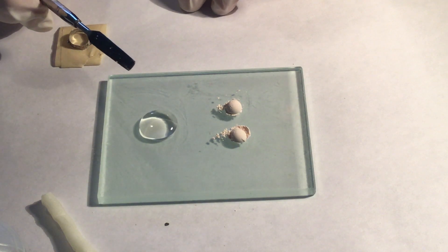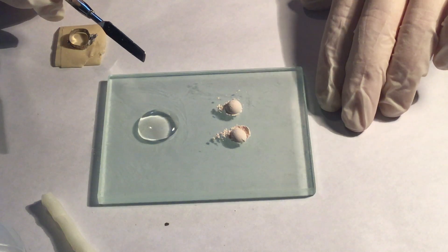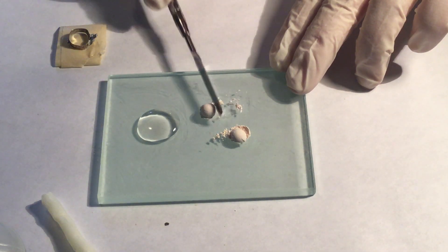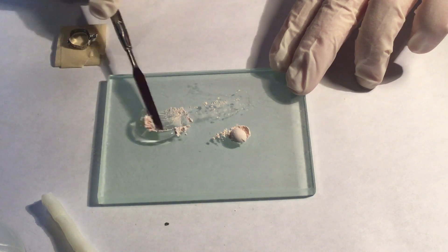Using the flat side of the small metal spatula, incorporate the powder into the liquid, using small increments suggested by the manufacturer's instructions.